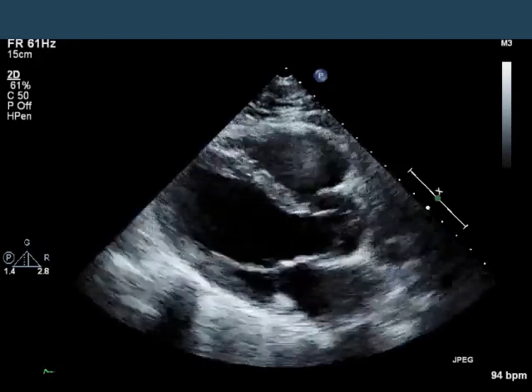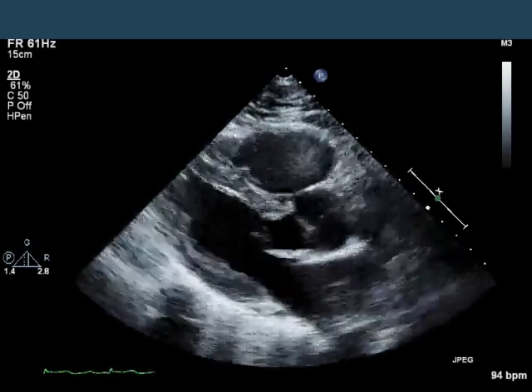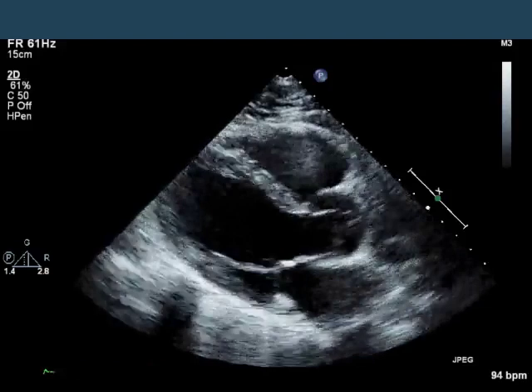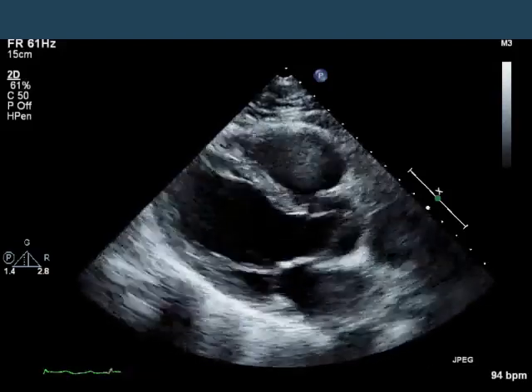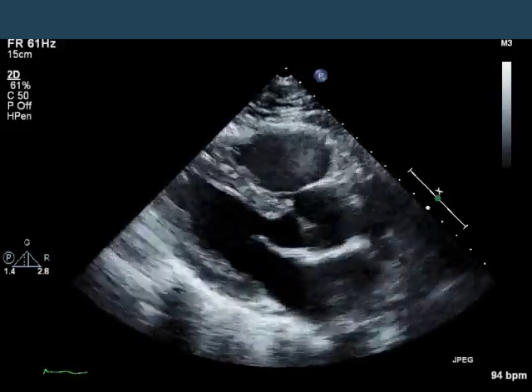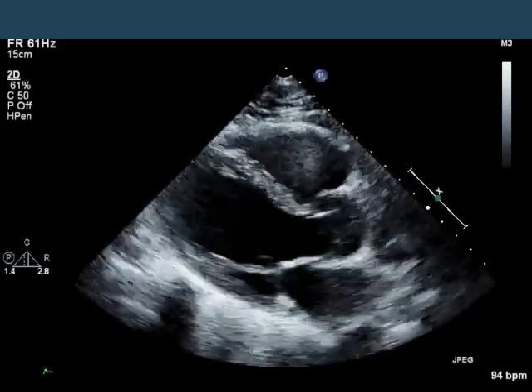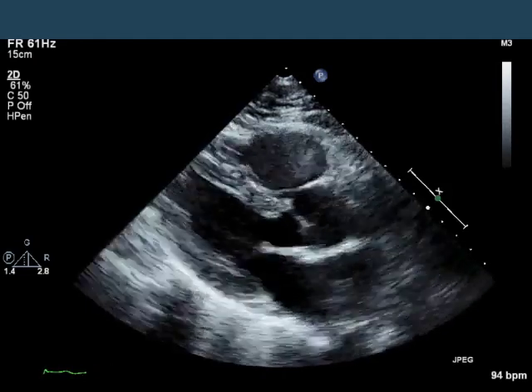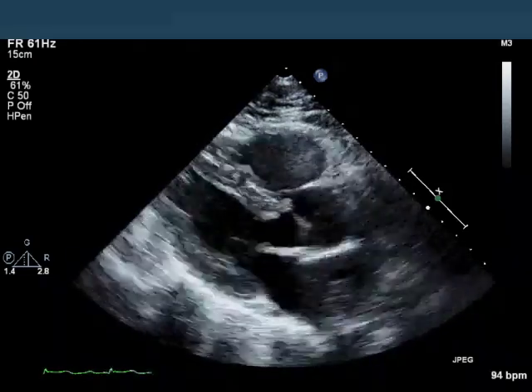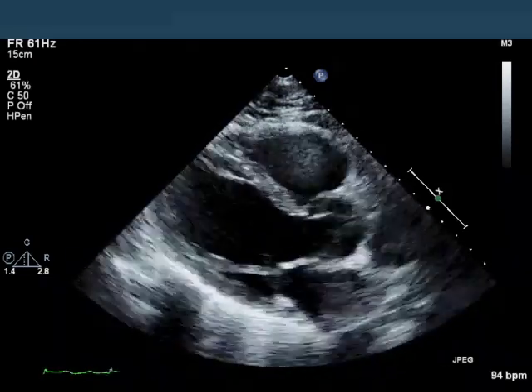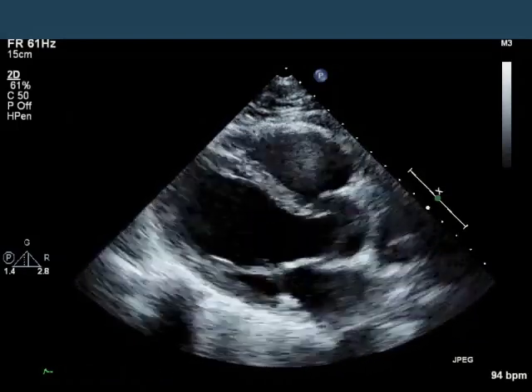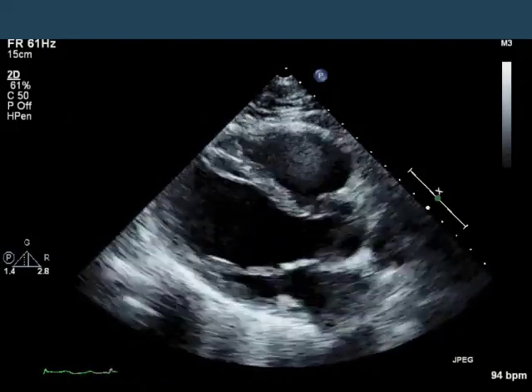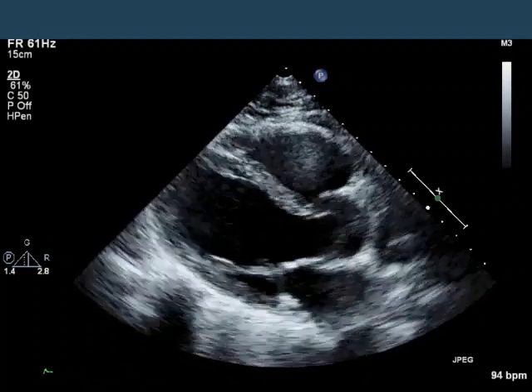We see here a 2D parasternal long axis image. Grossly, the aortic and mitral valves look okay. The aorta is normal in size. The right ventricle, at least, appears to be relatively okay, and there are no overt wall-motion abnormalities in the LV in this view.